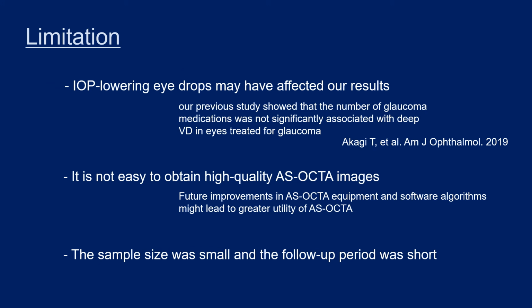Limitations: IOP-lowering eye drops may have affected our results, and it is not easy to obtain high-quality OCTA images. Future improvements in OCTA equipment and software algorithms might lead to greater utility of OCTA. And the sample size was small and the follow-up period was short.